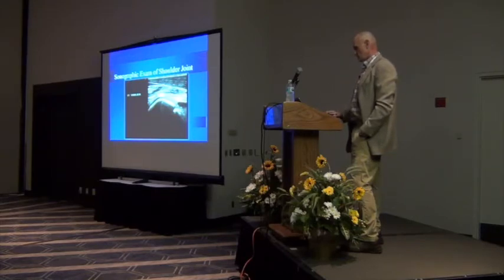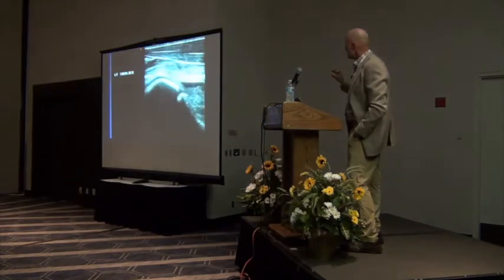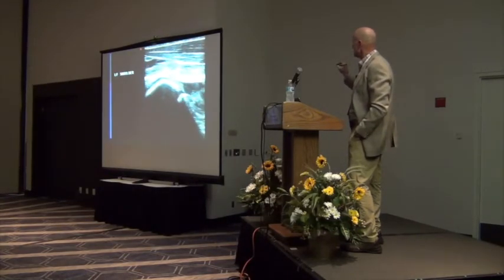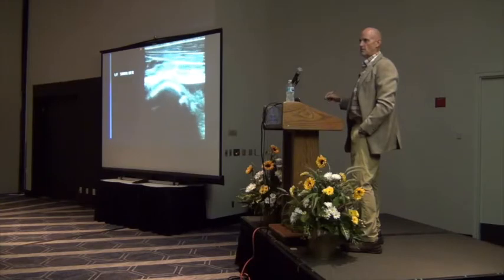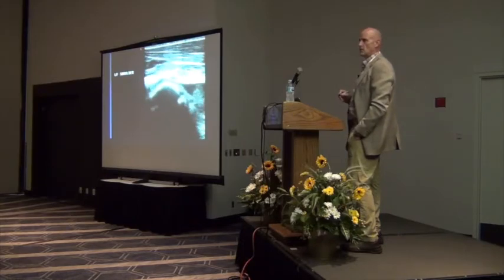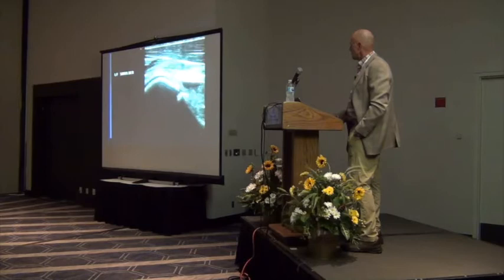And this is just kind of an interesting shoulder in that it makes sense if you think about it. This is a young foal. It's got a physis right here, humeral head and physis. And as you push on the probe, look where the fluid accumulates in the shoulder joint underneath. So we know this horse has some intra-articular pathology of some sort. It doesn't appear to be the humeral head, so we need to be a little bit more careful to evaluate the glenoid cavity with radiographs.